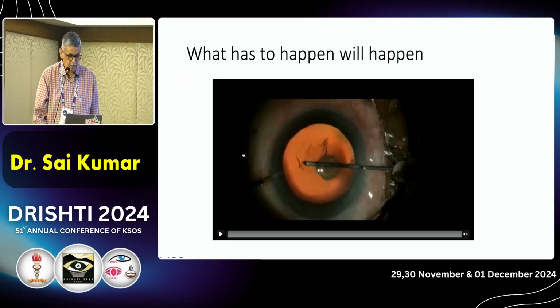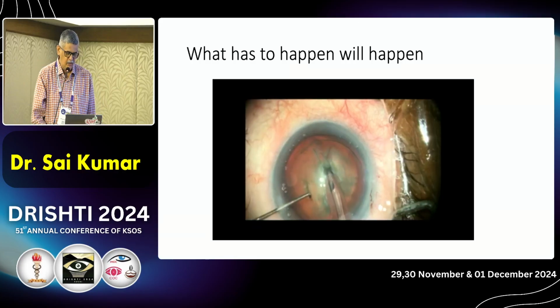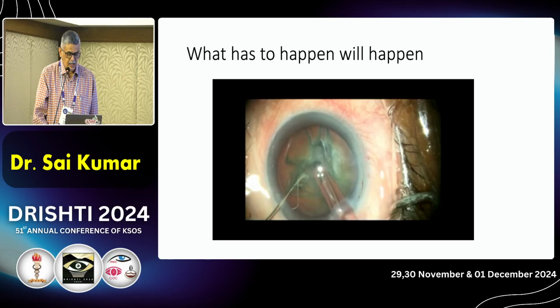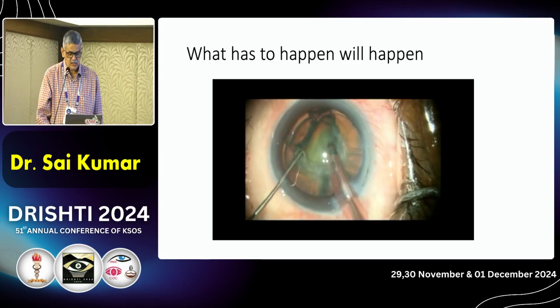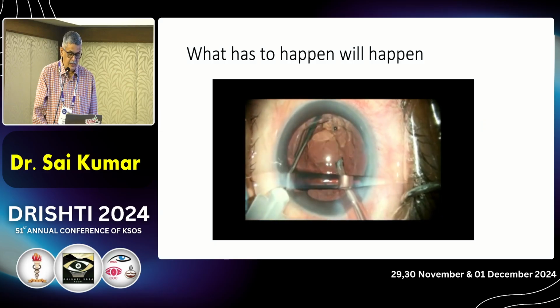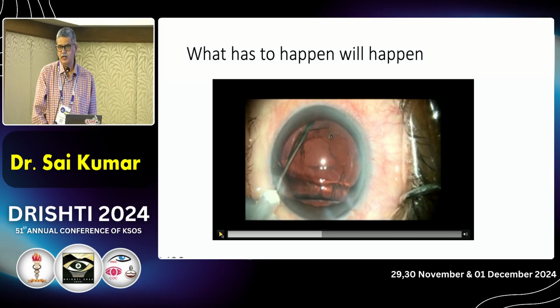And finally, in Malayalam we say Varanulladu vazhi thangula. And in English we can say what has to happen will happen. So this was a posterior polar cataract where again I did everything well. The nucleus fragmentation goes on just like my routine technique, and I slowly break open the pieces, and without any rotation, using the Sinskey hook, I slowly manipulate the pieces into the phaco probe. And I'm done here. I'm going to inject Cohevisc inside the eye, and the cannula slips. Okay, the cannula slips, goes deep into the vitreous.